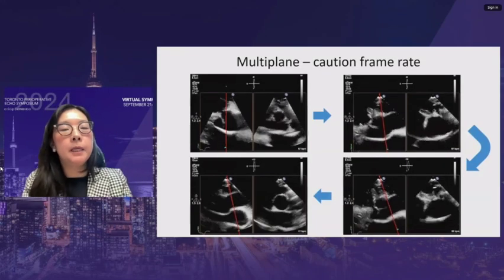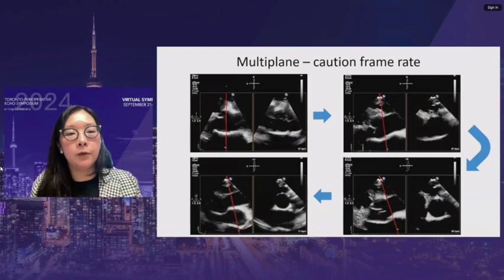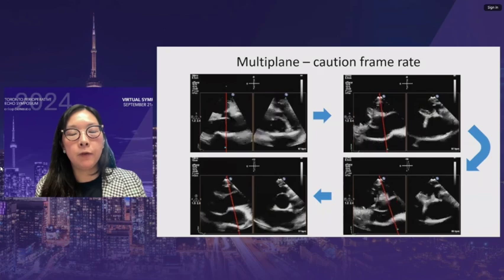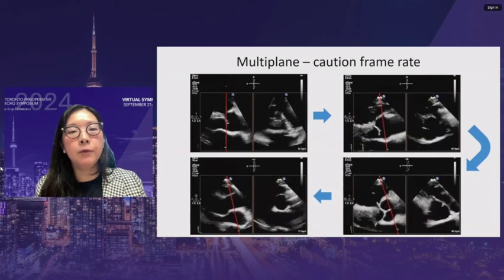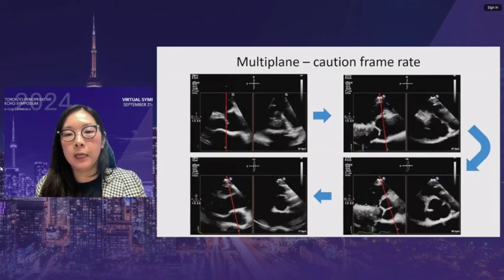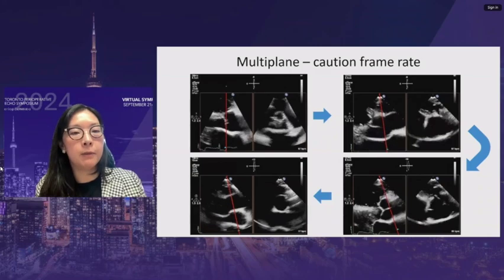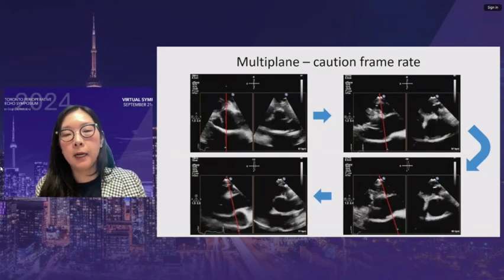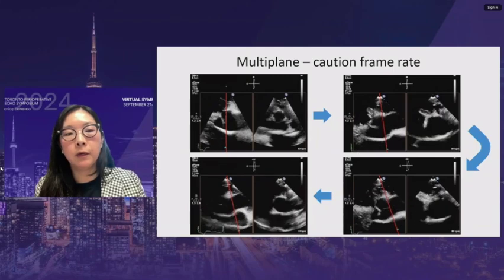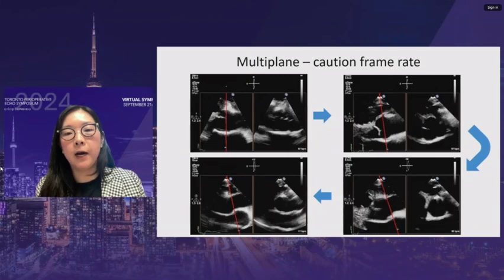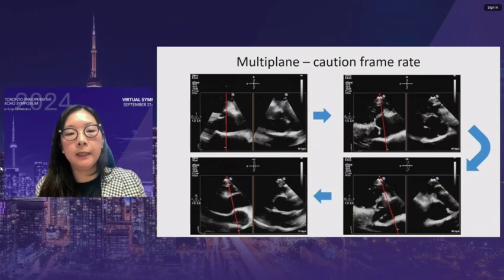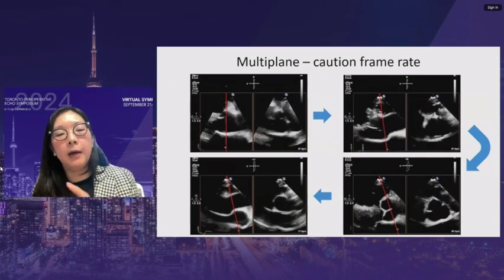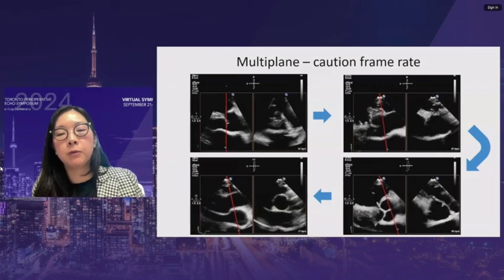Multi-plane or X-plane modes can improve imaging when struggling. Caution is needed regarding frame rates — smaller vegetations can be missed. However, for identifying spaces or abnormal thickening, multi-plane is very helpful, allowing sweeping from the aortic valve up through the sinuses and into the ascending aorta while looking live for thickening or spaces that shouldn't be there.